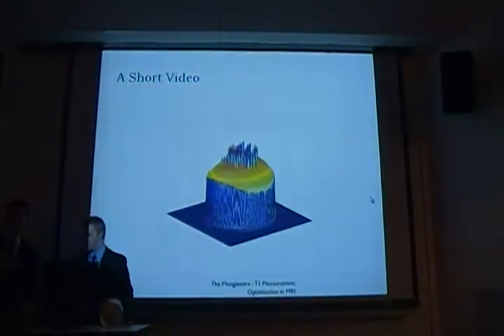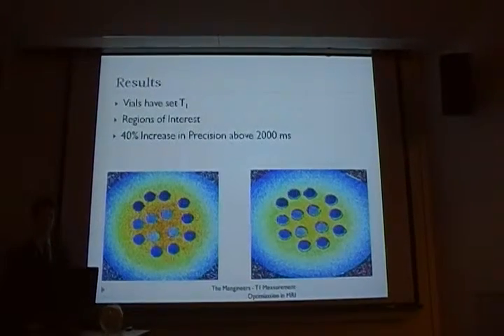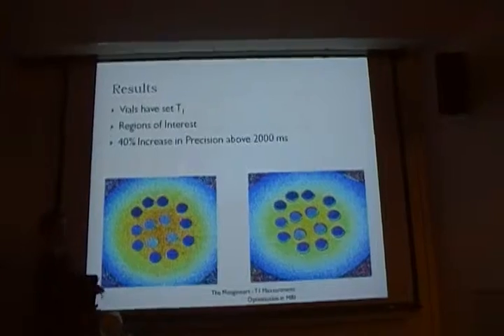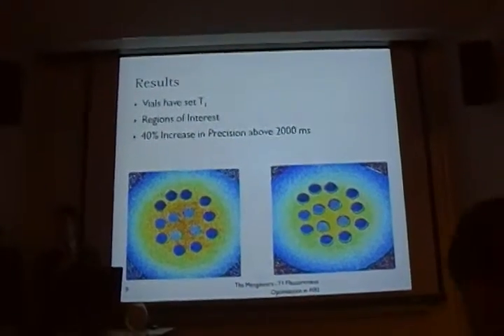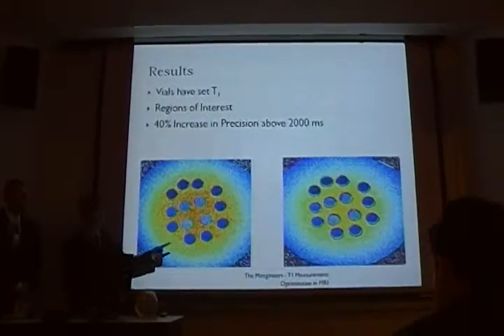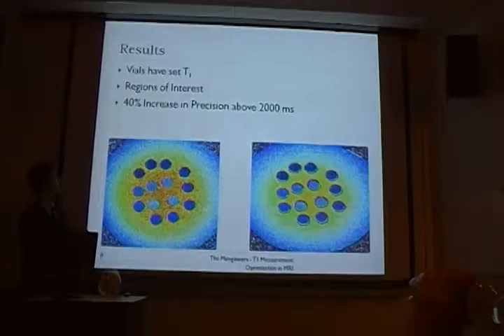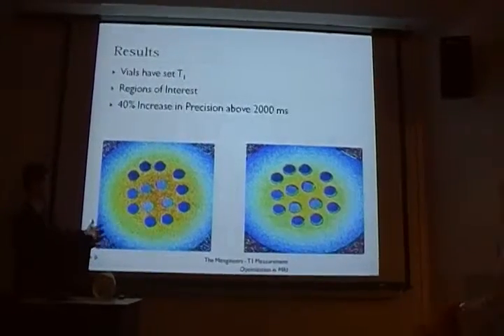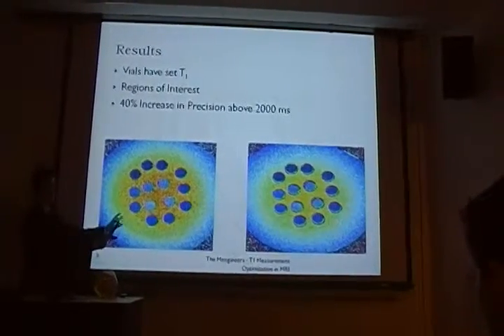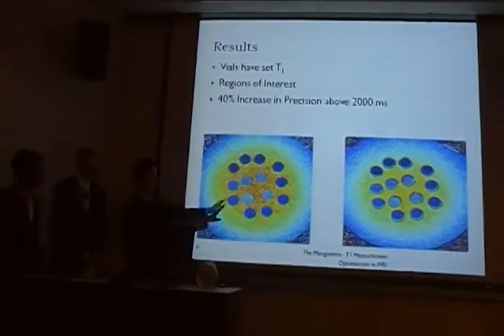Sorry about that, the skipping, that wasn't supposed to happen. Okay, so what we're looking at here is essentially calculated T1 values for DESPOT, the original DESPOT, and our optimized 3-point design on the rig. You can see, essentially with your naked eye, that this image is characterized by a large degree of discoloration.